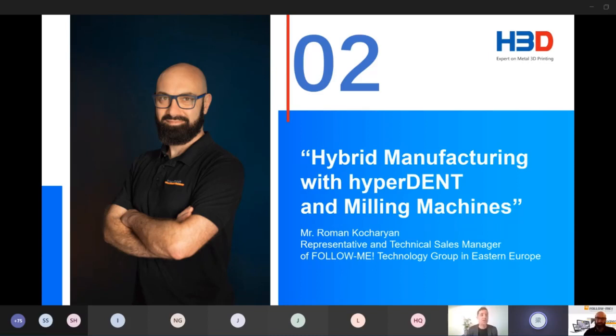Okay. And Roman, if someone has an HBD 150D printer plus a milling machine, what else should they have to initiate the hybrid production? First of all, as I mentioned above, we should know if the machine supports the touch probe. Of course, the touch probe is a high quality, high-tech invention. Not all the machines are supporting this touch probe, but touch probe provides us better accuracy in positioning. Of course, we are working on developing special high accuracy fixtures to support machines without a touch probe. But at the current stage, we can't do that. So let's say the work is in progress.